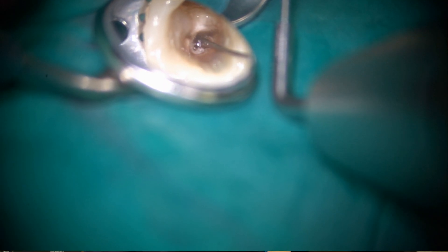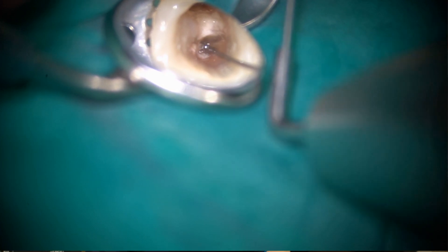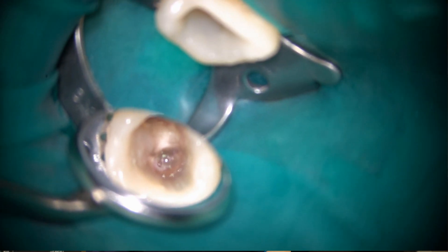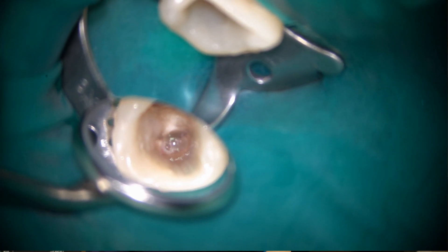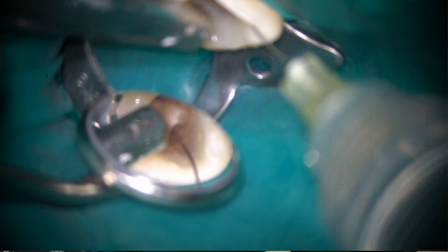I'm using a pulsing and pecking motion at the same time. Then I irrigate the canal again to remove debris.